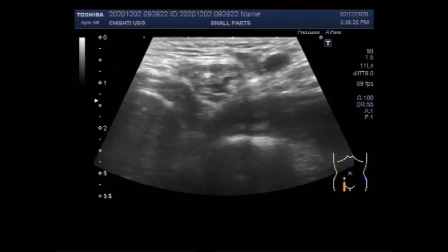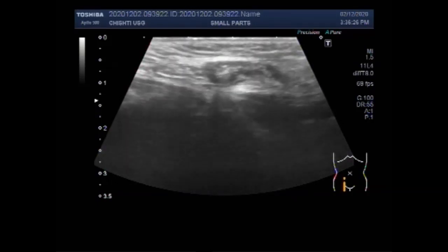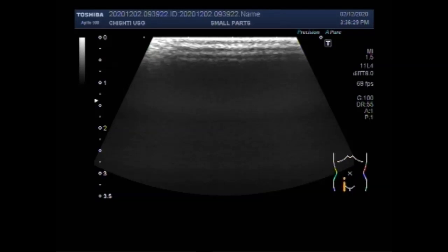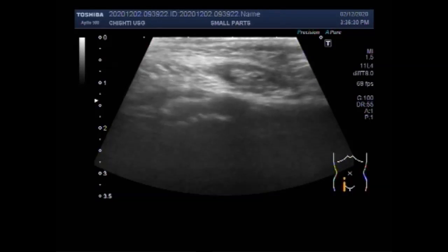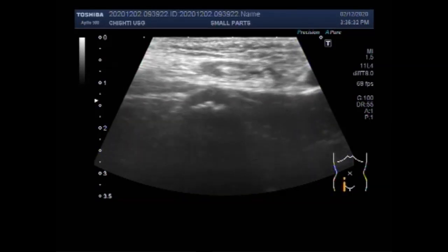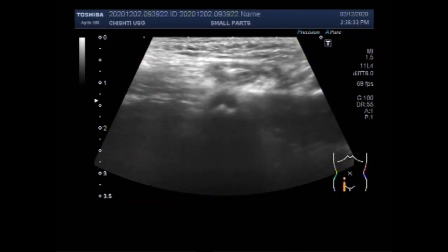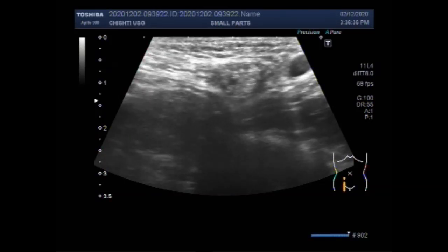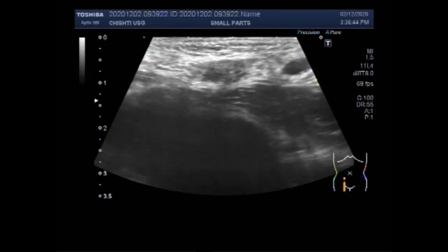You can see the inguinal canal — the right inguinal canal — and the gut loops are protruding into this inguinal canal and into the right scrotum.